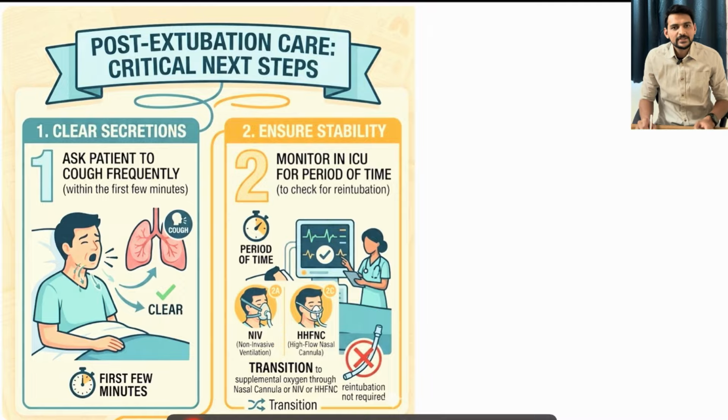Okay, now if cuff leak test is also positive, then we will proceed with the extubation. Once extubated, what should be the next steps? We should ask the individual to cough frequently within first few minutes so that there will be clearance of secretions if anything is present in the airway.